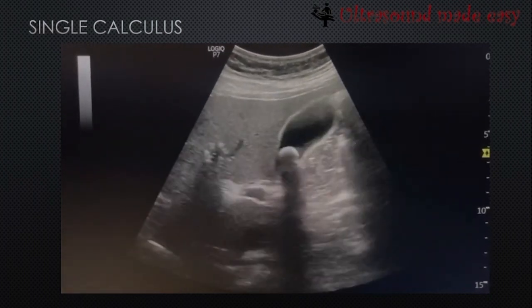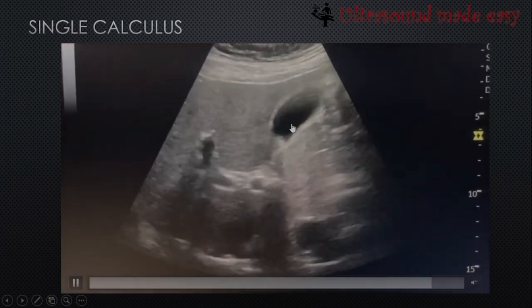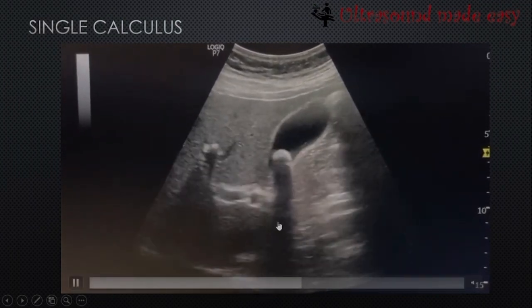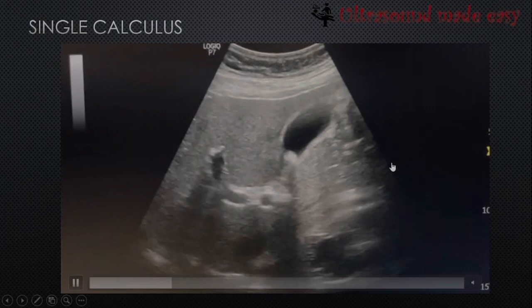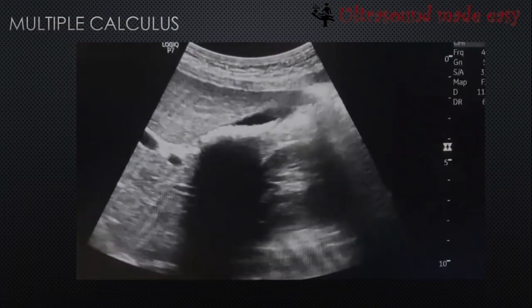In this case, we are seeing a distended or normal gallbladder, and there is a single calculus giving strong posterior acoustic shadowing. The single calculus was found during the ultrasound exam of this patient. This is the case of a single calculus.